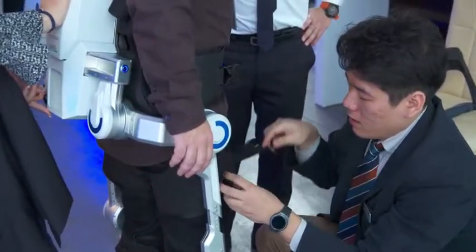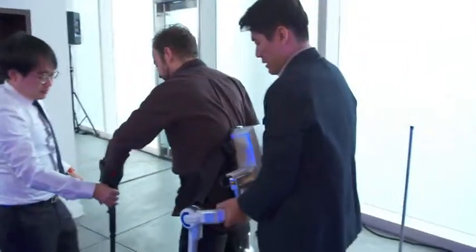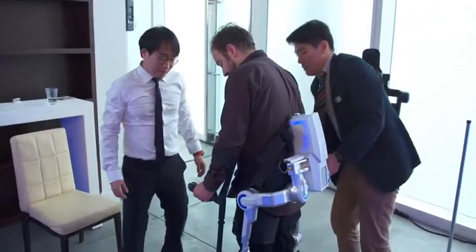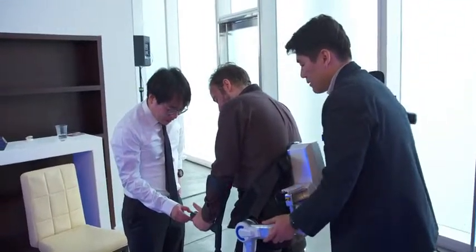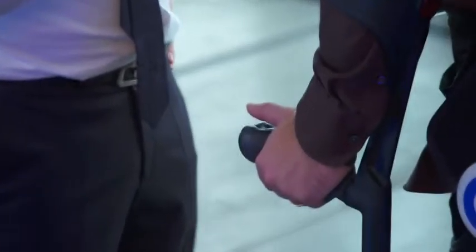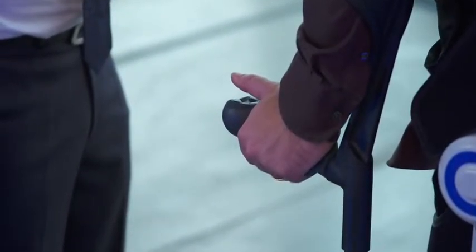Now you cannot move your whole body — correct? I'm a prisoner. Right hand. Button A is this one. Don't push this one. Button A and button B, and just click one time. You're going to move your right leg.